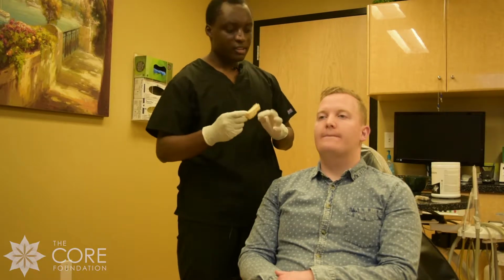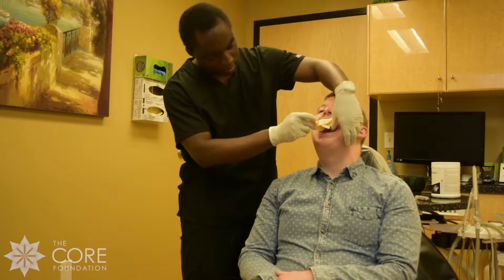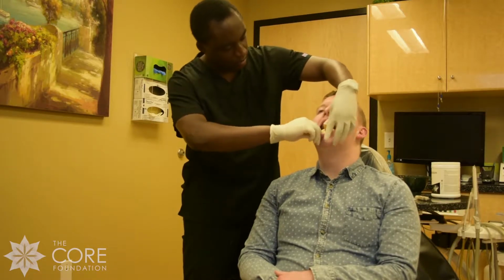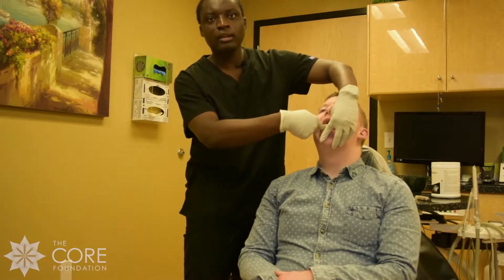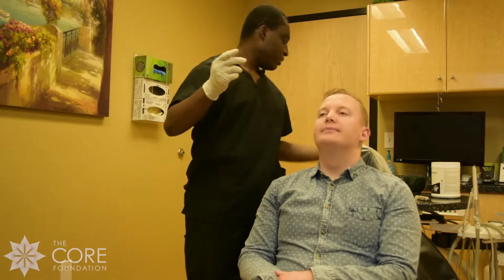Next, we're going to size up his lower. This is a small tray. Go ahead and open. Okay, and then the small tray fits perfectly on him. We're just going to try the medium.